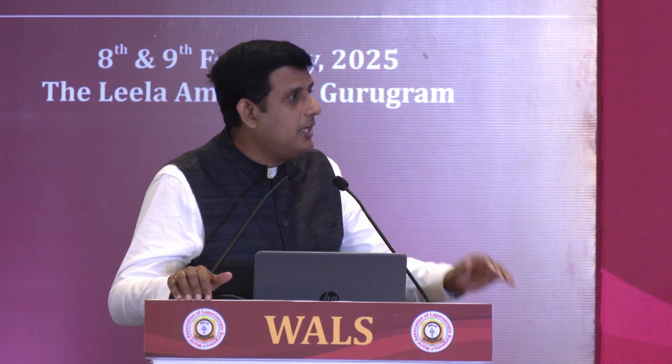It's the same, sir. They're the same. Same. But how is it that it occurred only to the surgeons? Because one day I was told that even ERCP was devised by the surgeons, not by the gastroenterologists. No, actually, the length is the same. We use the pediatric endoscope most of the time even when there is an esophageal stricture, a difficulty, or post-corrosive strictures. At that time when you intubate, you use the pediatric endoscope as an oral endoscope.